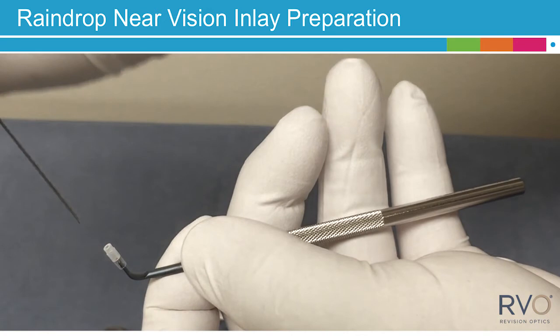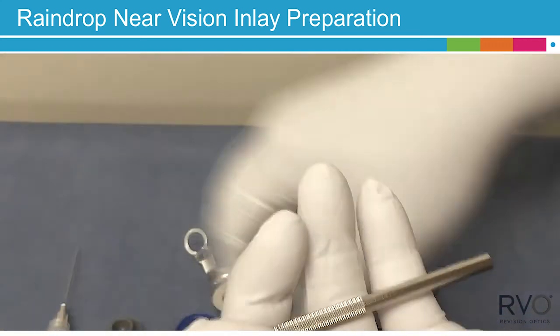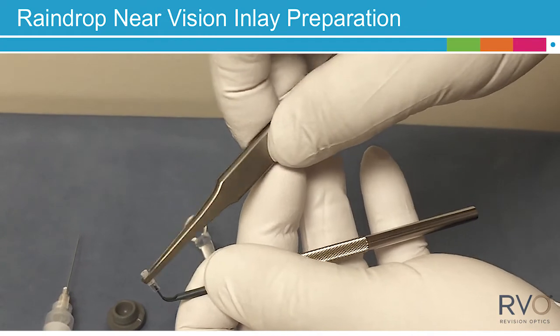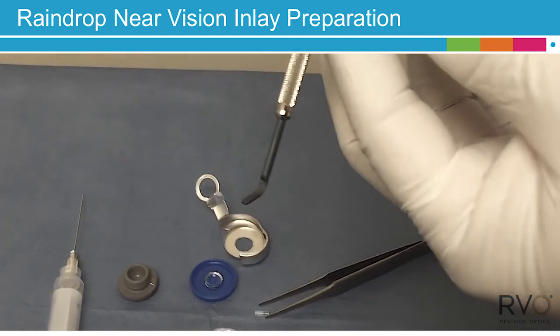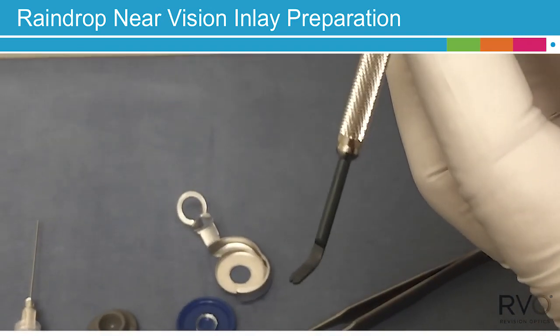When complete, remove the syringe cannula assembly from the cap hole in a straight upward motion, using the sterile forceps to remove the inserter cap. The Raindrop Near Vision Inlay is now ready for immediate surgical delivery.